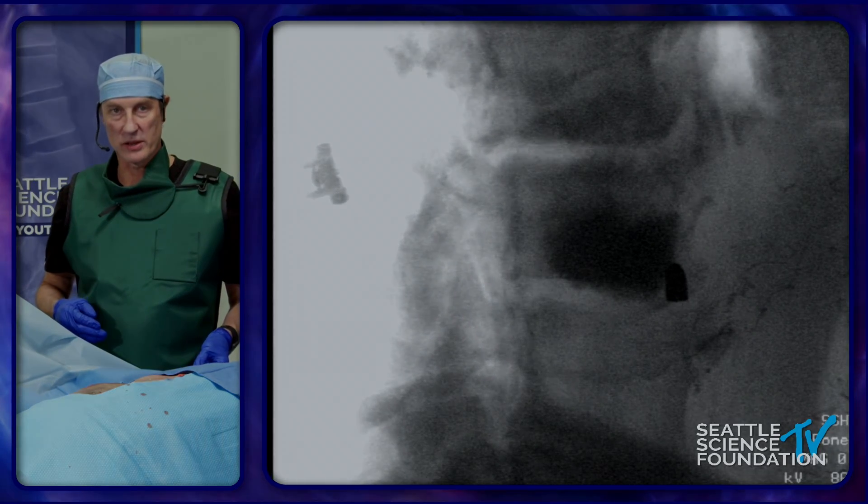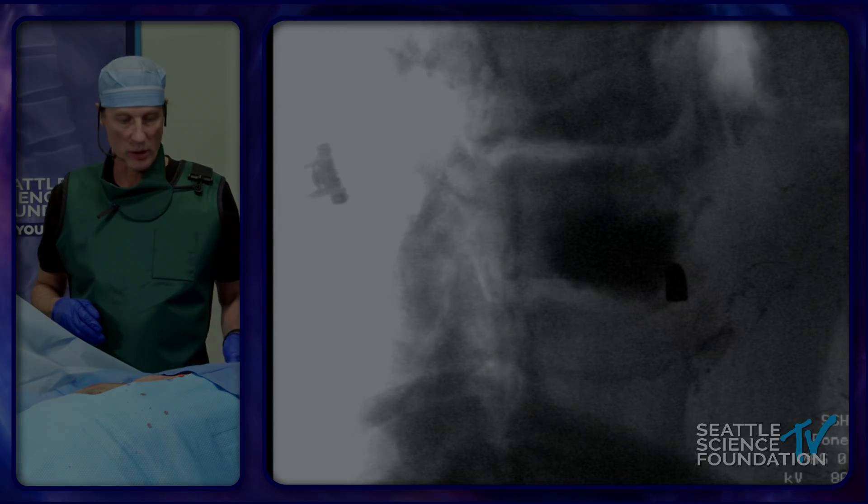Okay, that's vertebral augmentation with the Merit Arcadia balloon and the power curve.